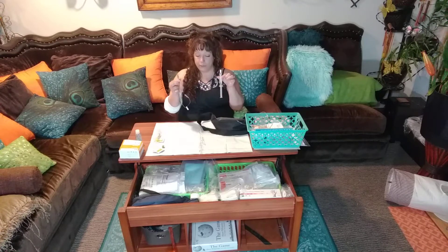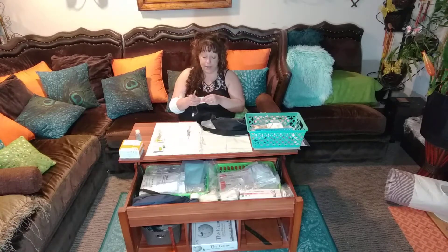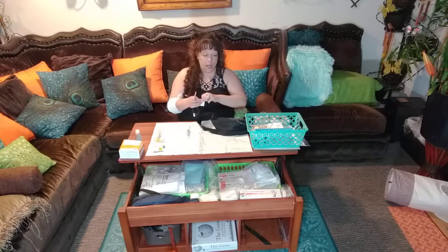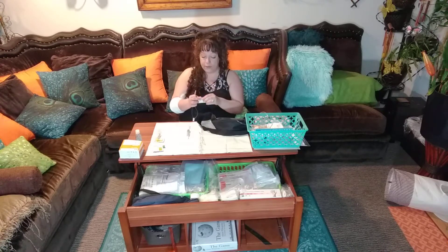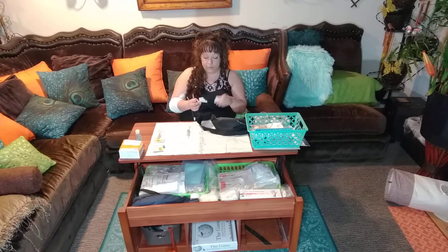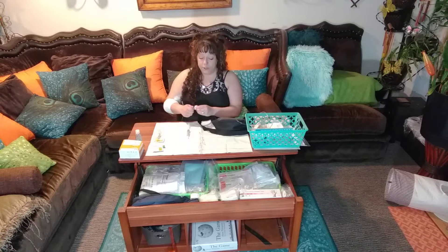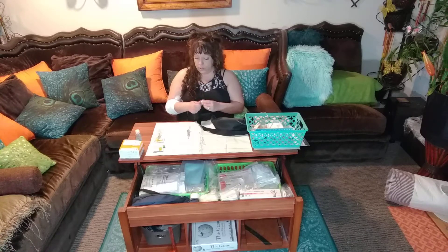I've now cleaned my line. To be honest, this is what I mean by my brain fog thing — I've actually forgotten if I cleaned the tip or not. So I'm going to go back and clean it again because I'm extra paranoid. After throwing up and going through this whole process, it takes a bit of a toll on my body and I'm becoming really, really tired right now. I'm just trying to trek through it.